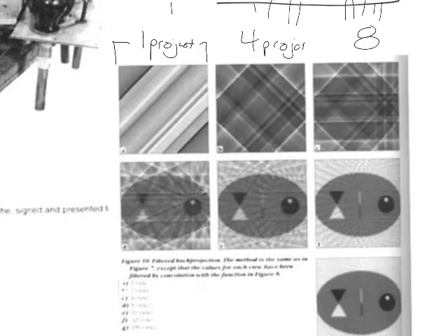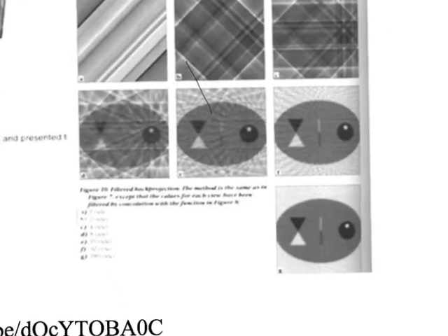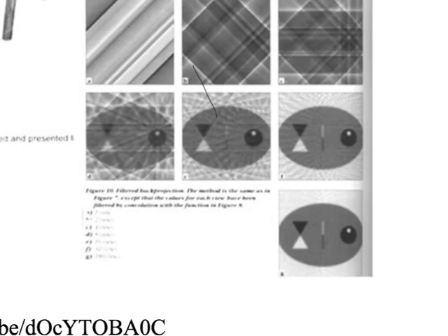So every single time, if you can imagine, it initiates an algorithm that's a repetitive process of just generating a world, which I think is pretty cool. In the CT scanner, it's going to do a repetitive process over and over again, iteratively, or we'll call it filtered back projecting the data until it has like 60 back projected profiles. And it can combine all those, and now we have what was inside of that cow's brain. At least a single axial slice of it.